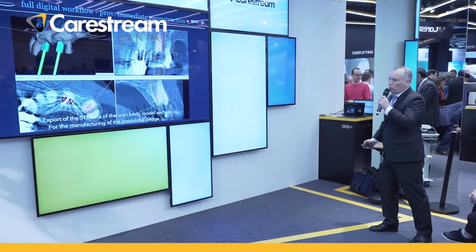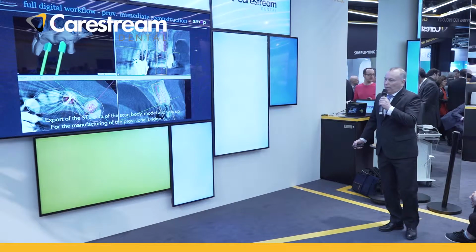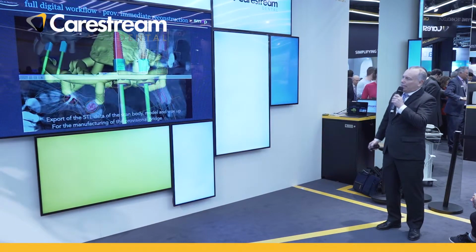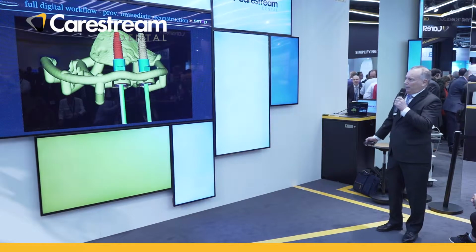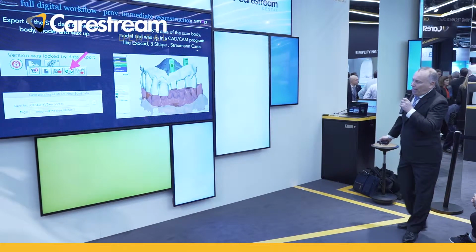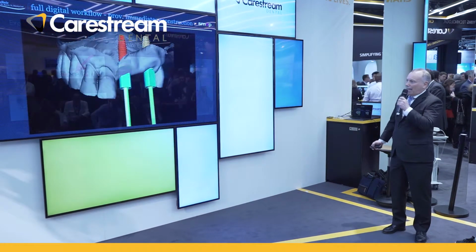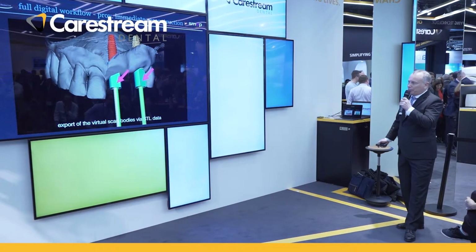And now we also want to export the position of the implants to a CAD/CAM program like ExoCAD. So in SMOP we have the possibility to export these blue scan bodies, or the virtual scan bodies. We can export the STL data of the model, of the implant position, and of these scan bodies, and import them in a CAD/CAM program.